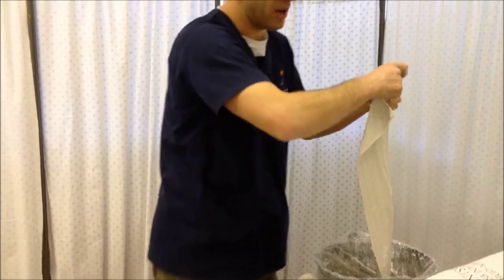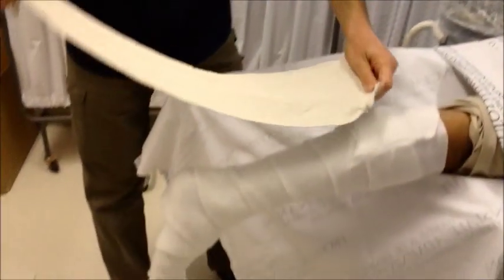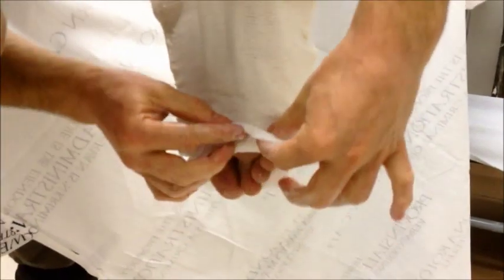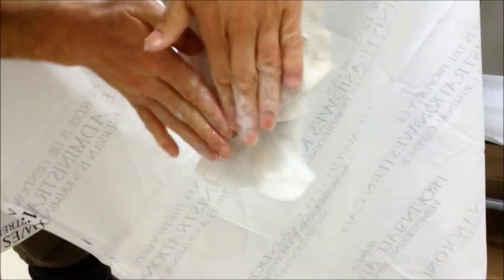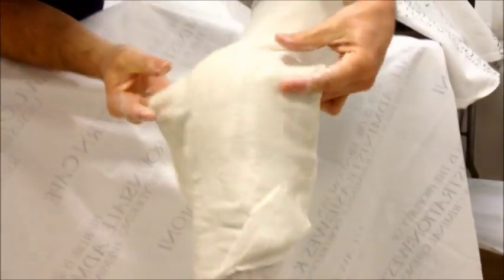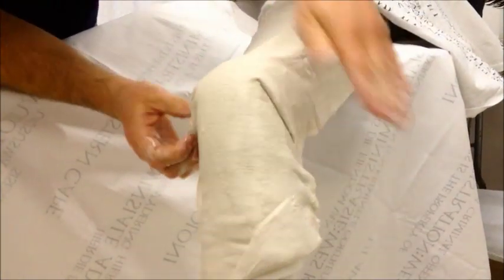The primary lamination will be on the injury. You can choose whether you want to lay from the top or the bottom — the bottom is the more tricky landmark, so I usually start from the bottom. Just checking — I'm lying here level with my big toe, but it will entrap my small toe. So here it's good practice to just tuck back this edge to free up the little toe. Make sure you lay it nice and flat. Around the ankles, don't leave these unneated edges — tuck it in neatly and laminate that in.